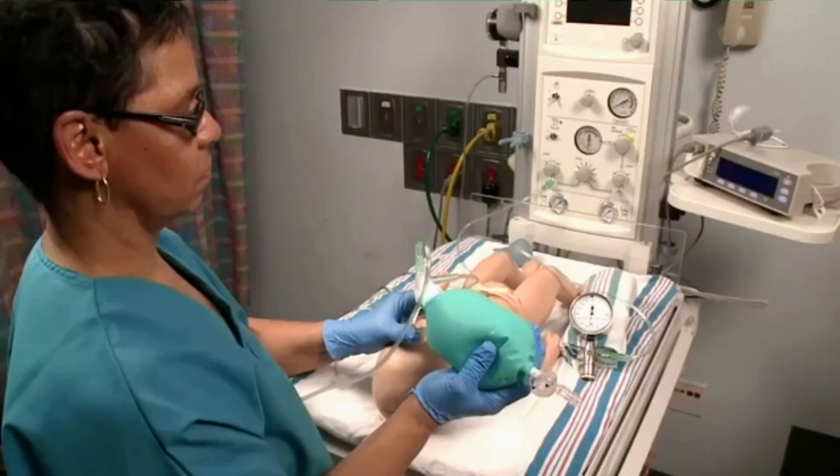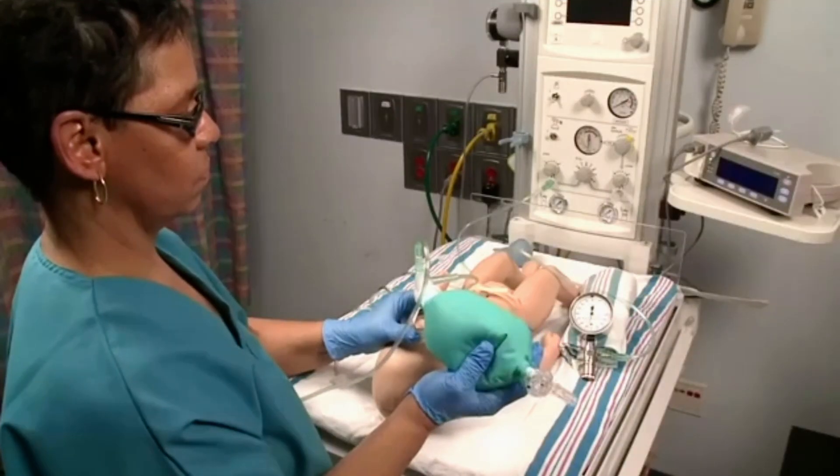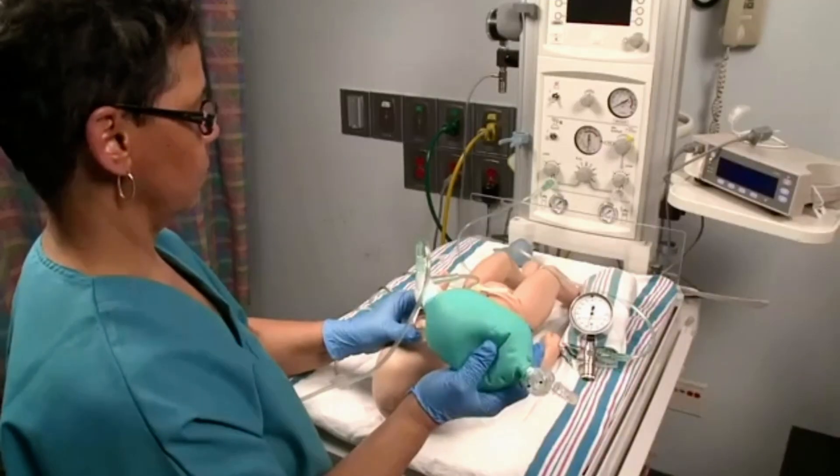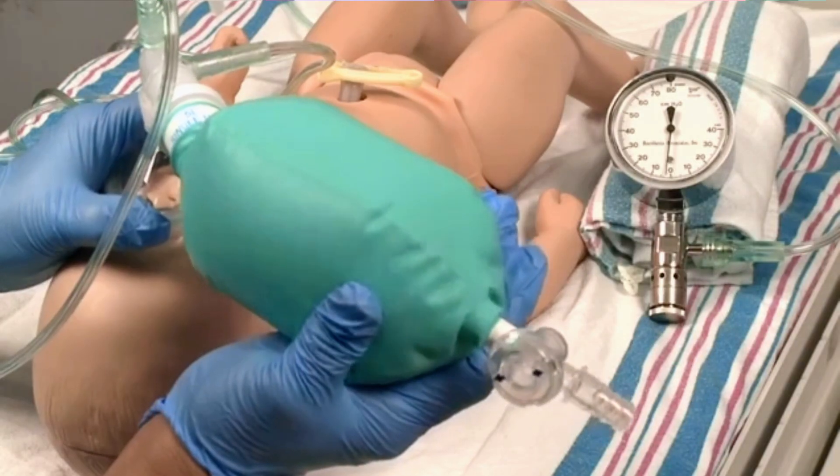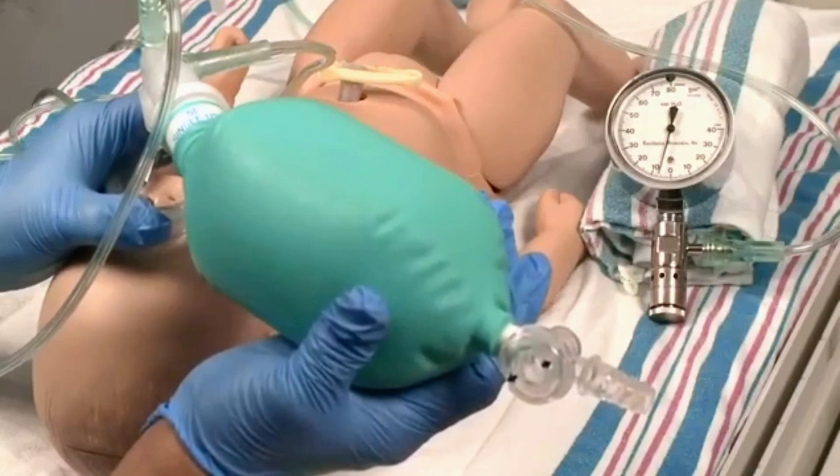Positive pressure ventilation is indicated when the newborn is apneic or gasping, has a heart rate of less than 100 beats per minute, and/or saturation remains below target values despite supplemental oxygen. In this section we will explain how a flow inflating bag works and how to use it.